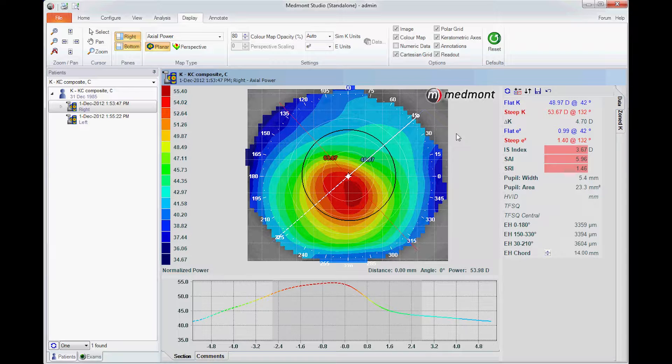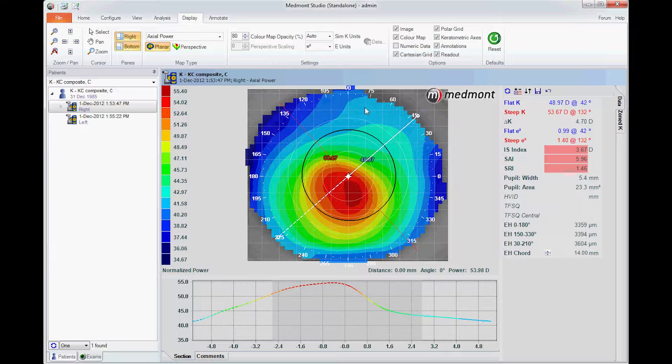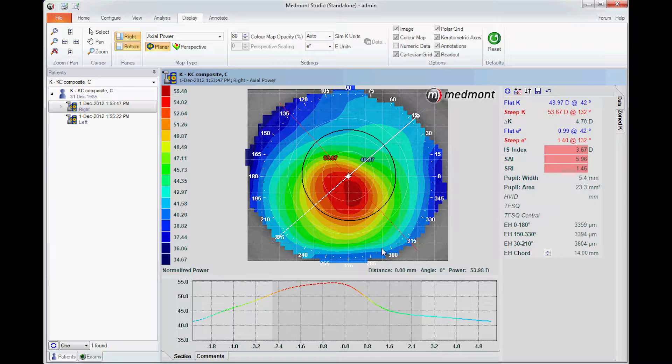Start by taking a composite eye capture imaging as much of the corneal surface as possible. The peripheral corneal shape has been shown in Pacific University studies to be able to estimate the angle of the surface of eye well past the cornea and into the sclera.